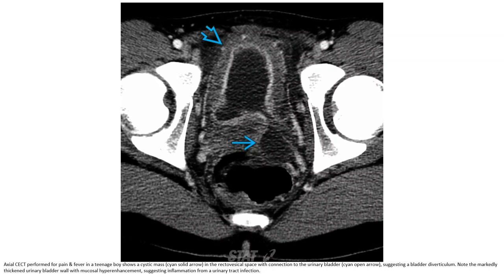Contrast-enhanced CT performed for pain and fever in a teenager shows a cystic mass in the retrovesical space with connection to the urinary bladder, suggesting a bladder diverticulum. Note the markedly thickened urinary bladder wall with mucosal hyperenhancement, suggesting inflammation from a urinary tract infection.